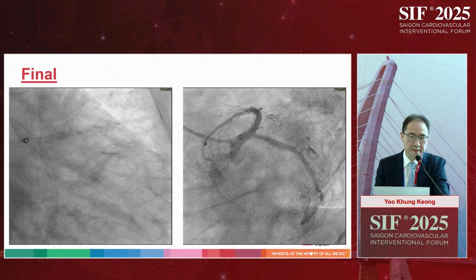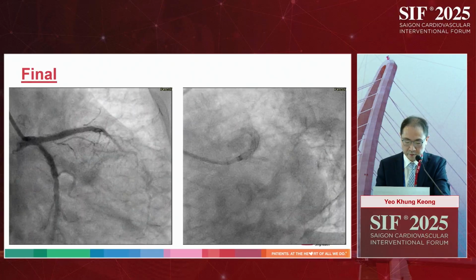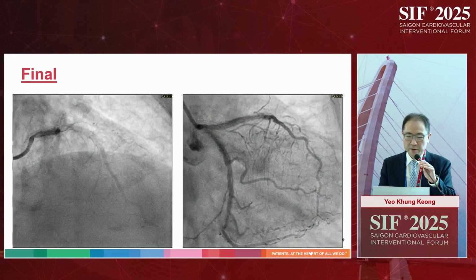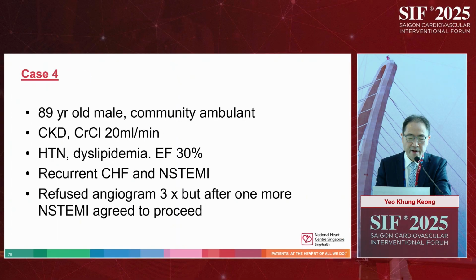So what did I do? I just stented the left main into LAD ostial, and then I just drug-coated ballooned it. So the result is acceptable. The patient came back, had some restenosis after 6 months, but eventually did fine.